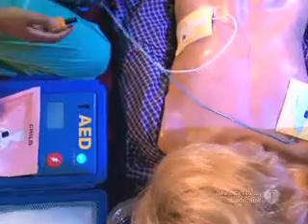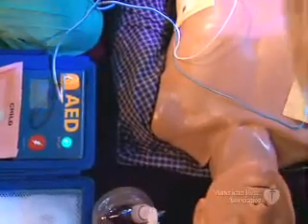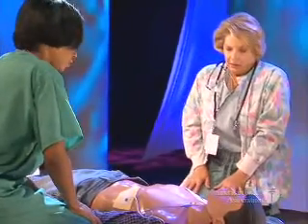With 2 rescuers, don't stop CPR until the AED pads are attached to the chest and you are ready to let the AED analyze the victim's heart rhythm. Plug in pad's connector next to flashing light. The AED is now ready to check the victim's heart rhythm. Most AEDs begin to check the rhythm as soon as the pads are attached and connected. For others, you press an Analyze button.